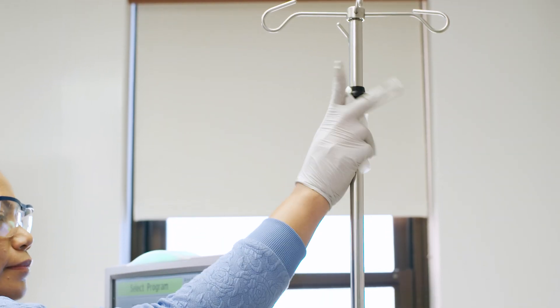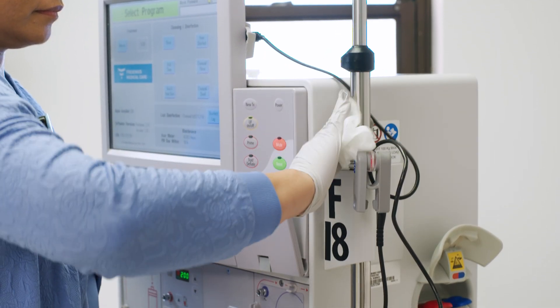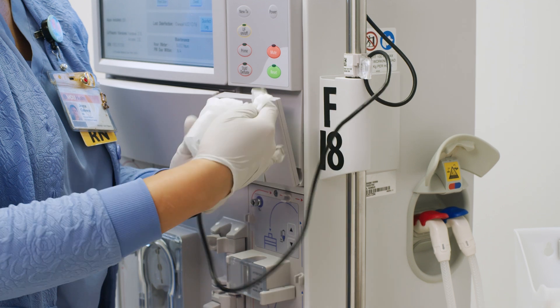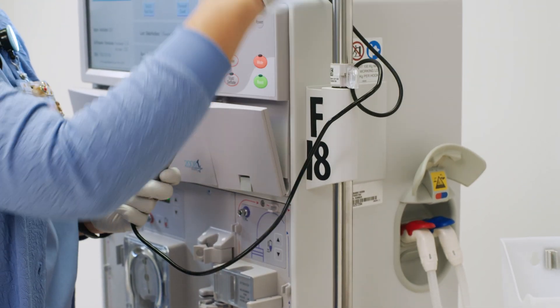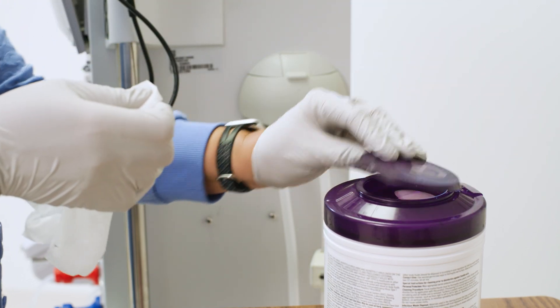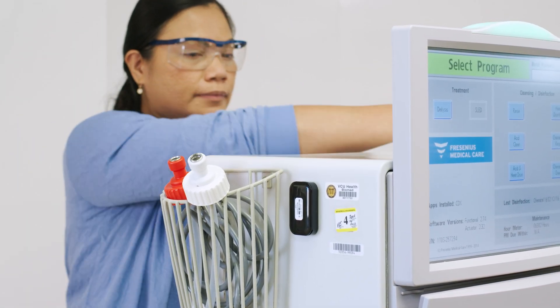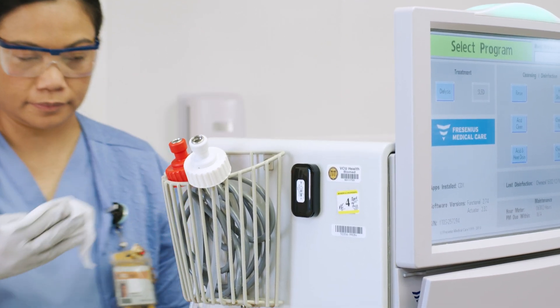Don't forget to thoroughly wipe the IV pole, blood pressure cuffs, and any other attached components. Again, starting with a wiping motion and friction, begin at the top of the machine and work your way down.